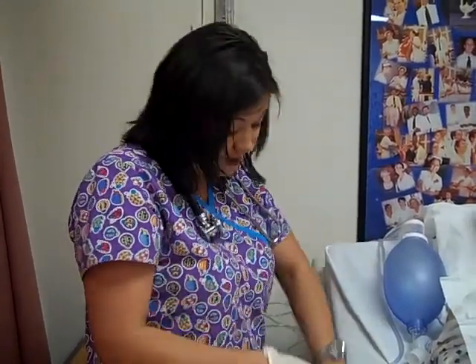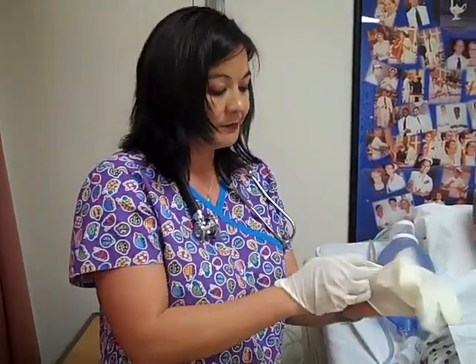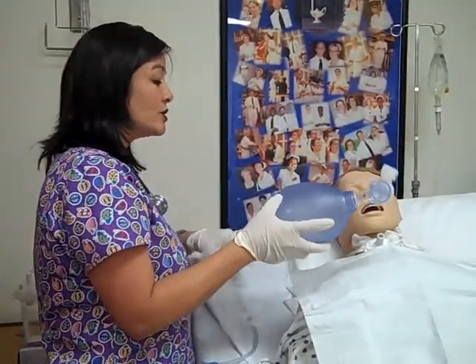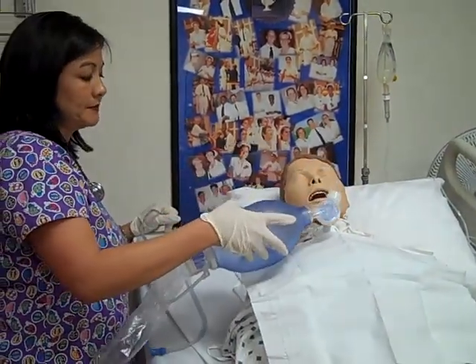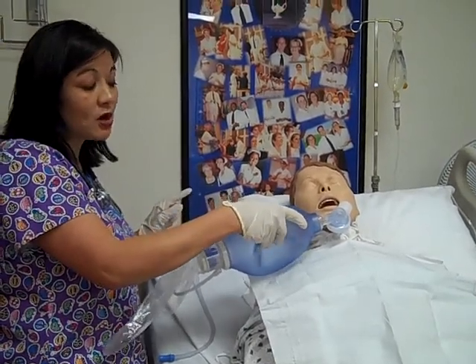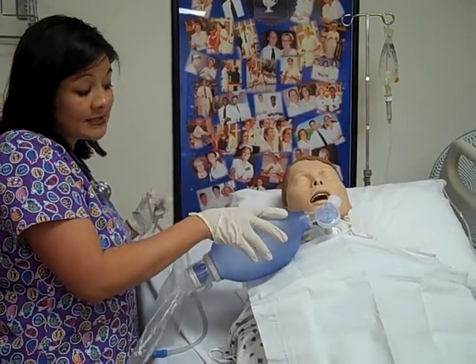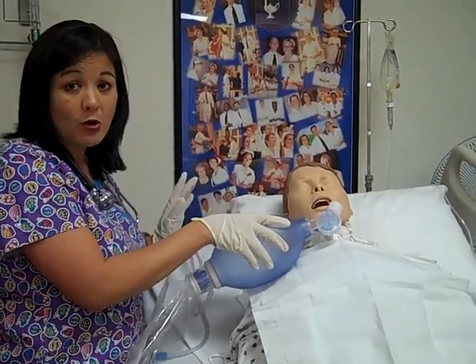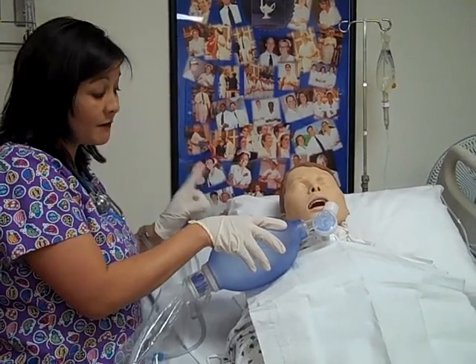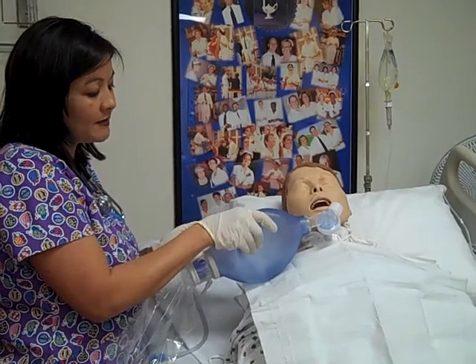I will have an SpO2 machine on him. I've washed my hands and I want to do this hyperoxygenation for about a minute. Another option is to put the patient on a blow-by, which is another oxygen device. Or if he were on a ventilator, I could hit hyperoxygenate on the ventilator setting to give him the appropriate breaths that he needs before I begin.